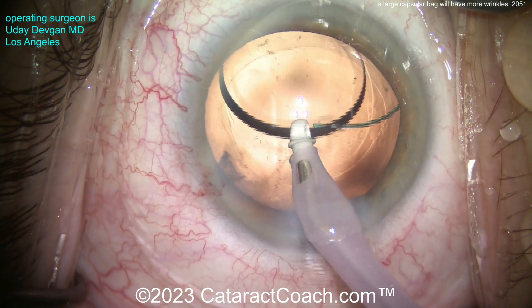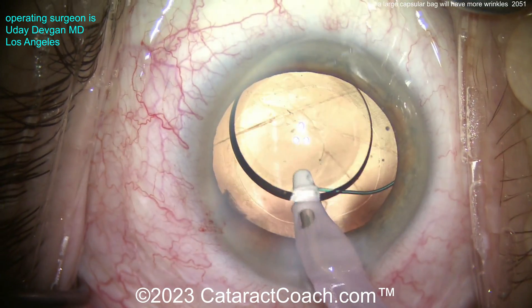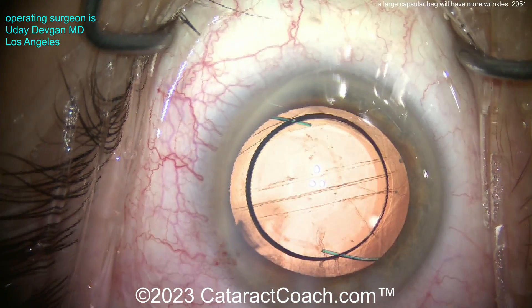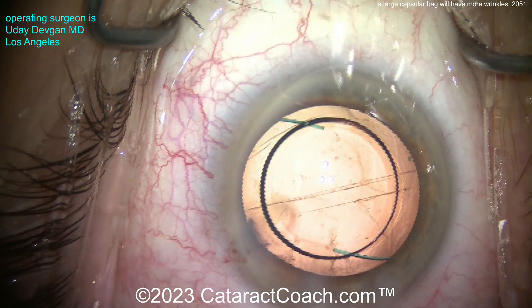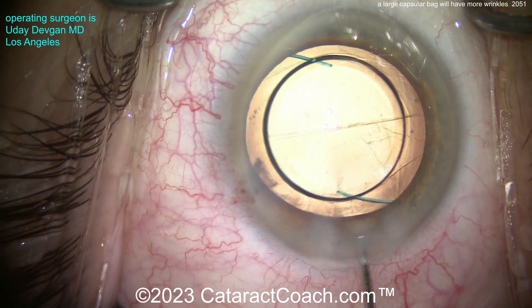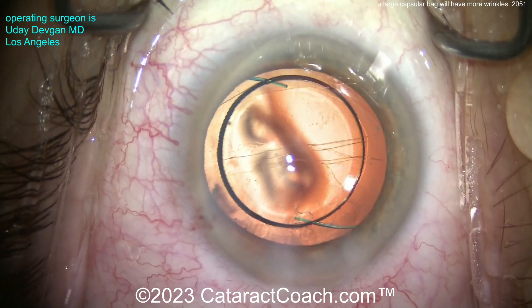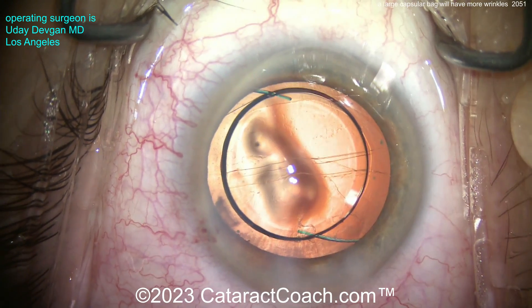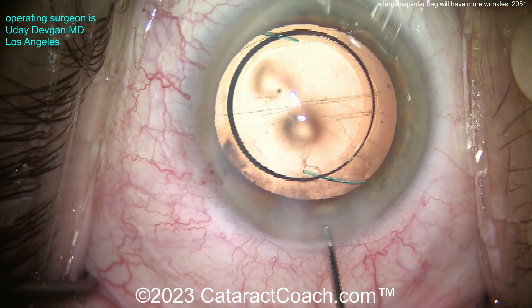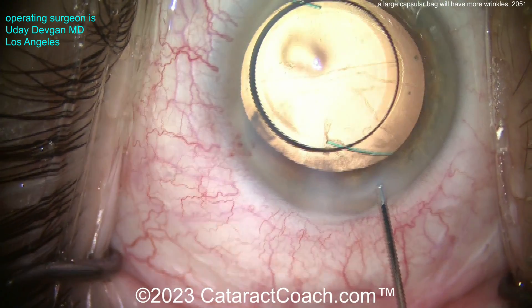Now removing viscoelastic — look what happens. As we remove the viscoelastic, that capsular bag is so big you see some wrinkles in it. You may worry: is the capsular bag broken? No, it's just wrinkles. Look at the orientation — they're in that direction because of the haptics pushing outwards against the capsular bag equator. Right in the center we've got some wrinkles. You could just leave it, let the patient heal, let capsule contraction happen, then come back in a couple of months and if wrinkles remain, do a YAG laser capsulotomy.